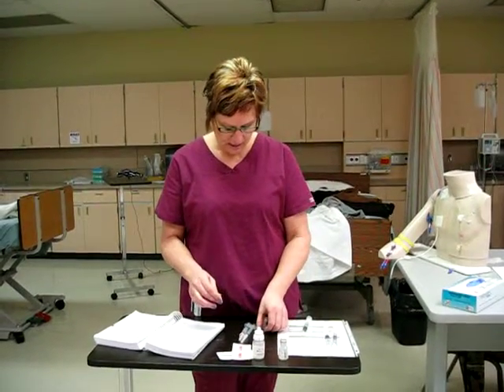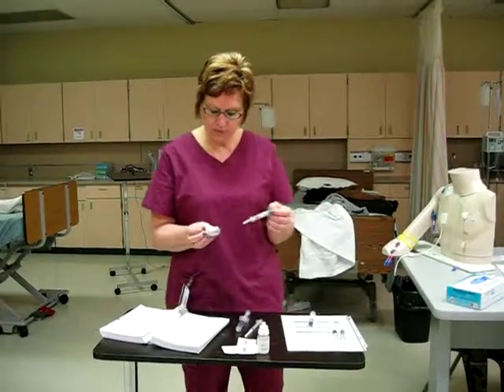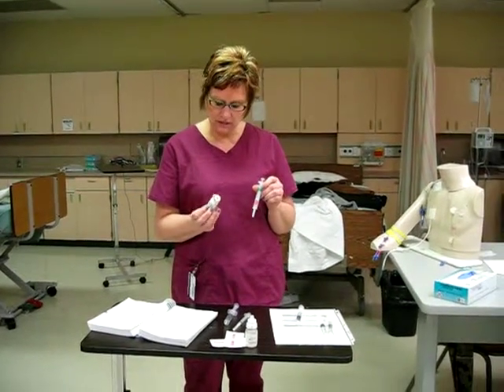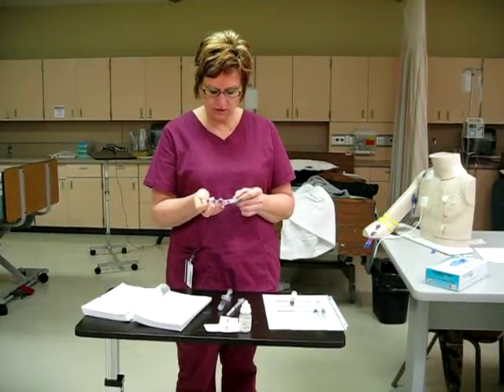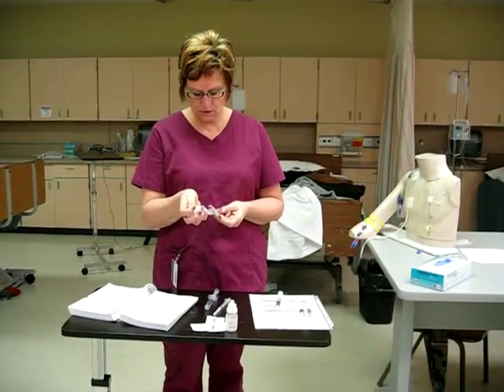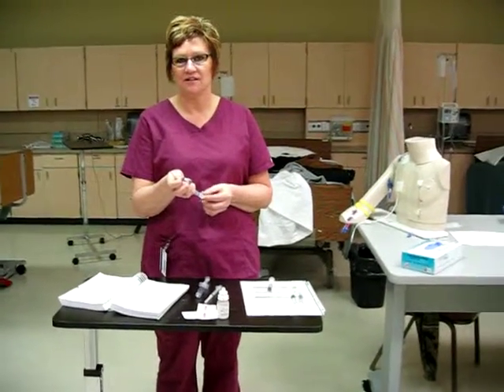And then I also have to have heparin for a heparin flush after I get done with my normal saline. And so heparin, we want to insert 3 to 5 milliliters, and so I'm going to insert 3 milliliters.